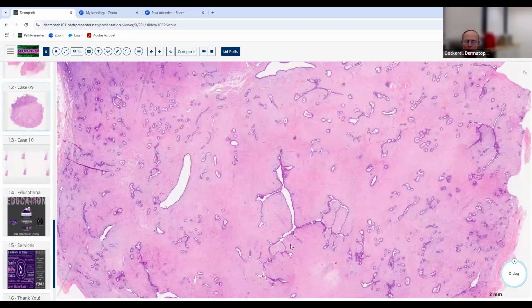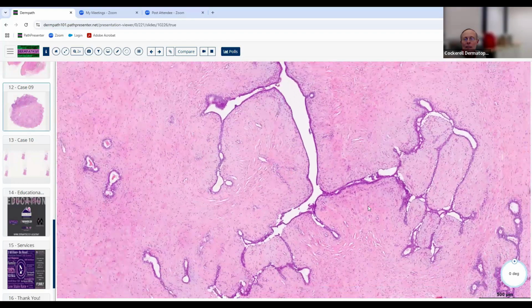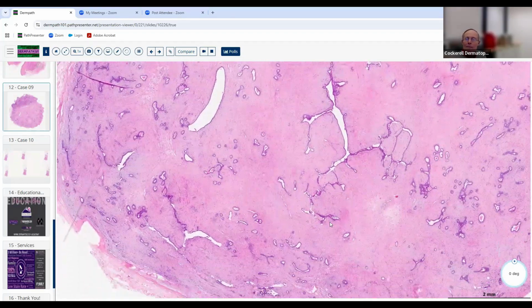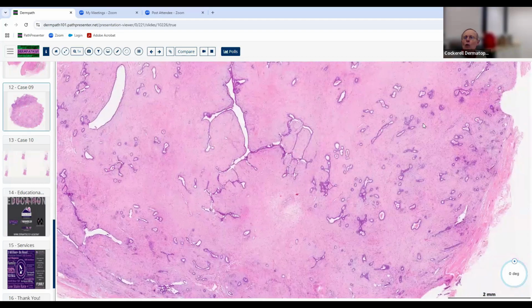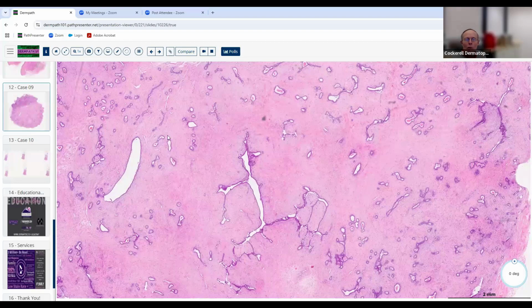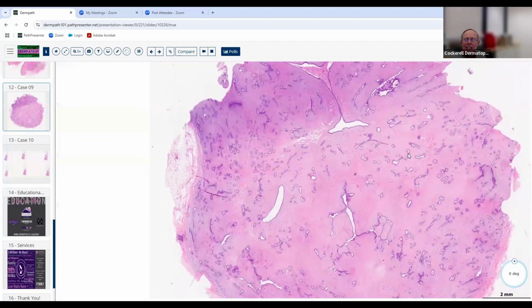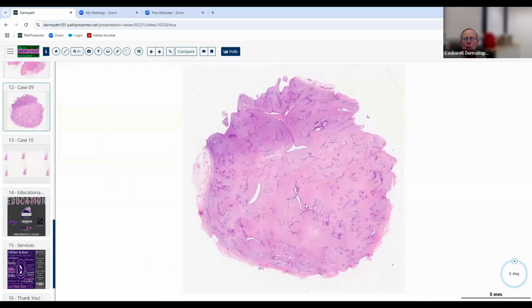So it's, again, another apocrine lesion, but it's got mostly fibrous tissue with relatively little glandular epithelium. But these glands look like this. They look like these little irregular networks of glandular structures that are coalescing and forming these little, almost like a neural network, if you will. So these things are communicating with one another throughout this big sea of fibrous tissue. Highly unlikely to appear on the board, but we're just introducing it to you and showing you.